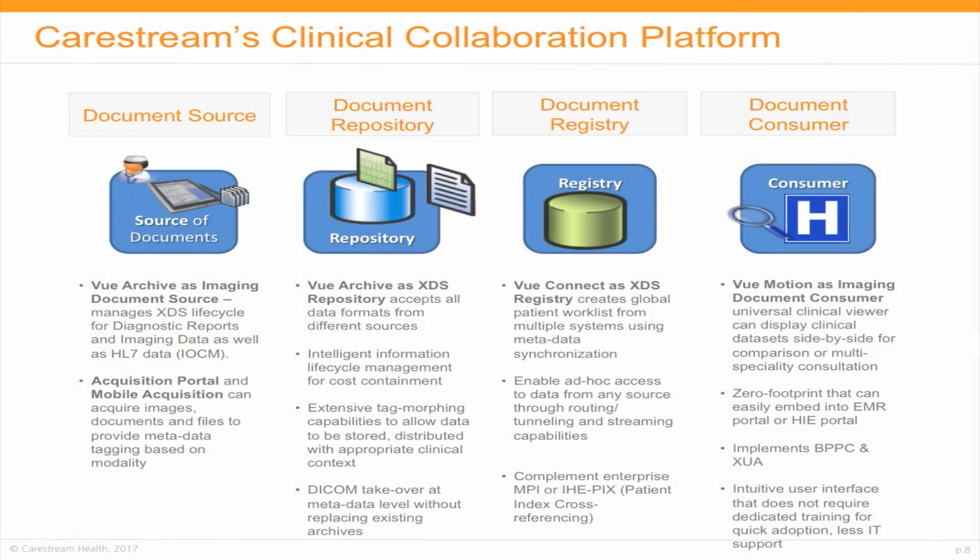Now, within XDS-I, there is an extra step which uses various methods in DICOM to actually load that study instance, that DICOM data. Carestream implements the following XDS and XDS-I actors. It starts with the XDS document source or XDS-I document source, where our VNA and PACS implement the source actor. So we can connect to an external XDS repository and external XDS registry.